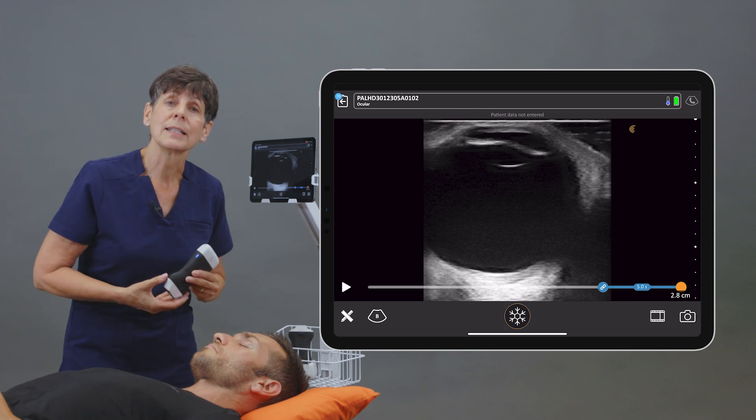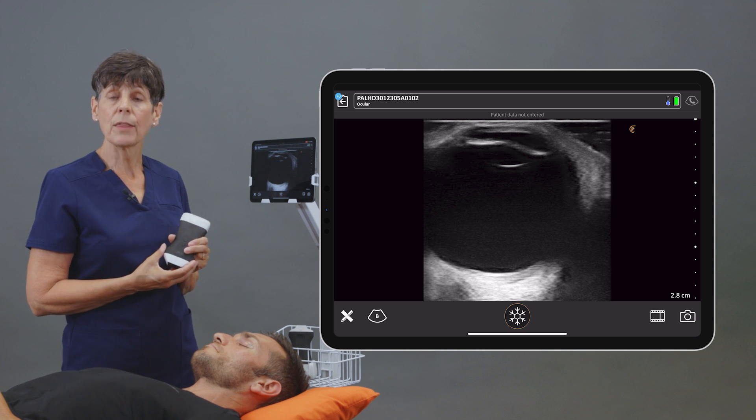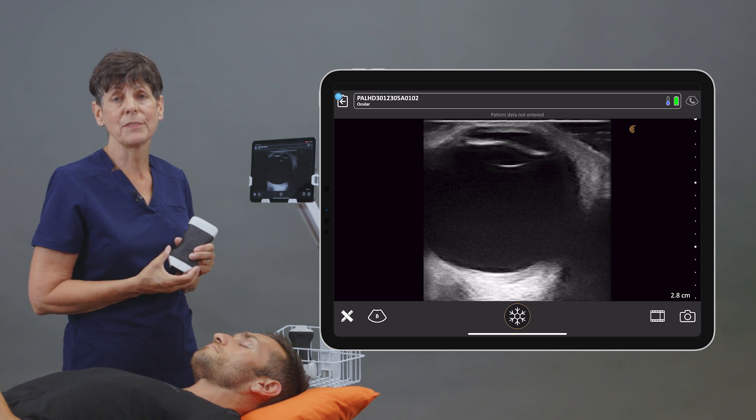As you can see, the PAL is an excellent choice for doing a quick and thorough examination of the eye.